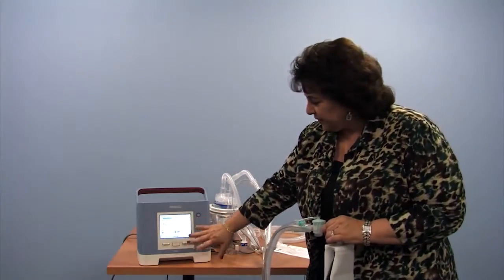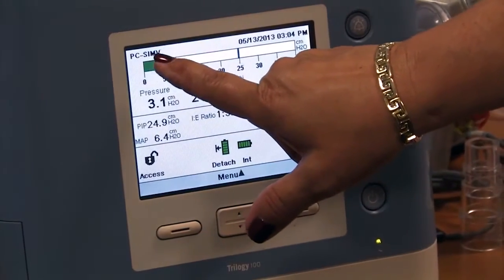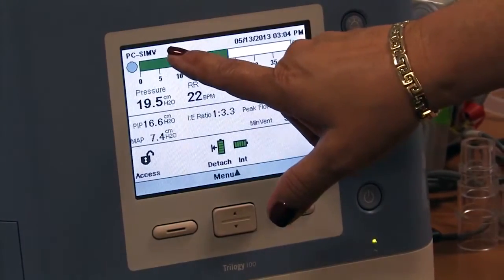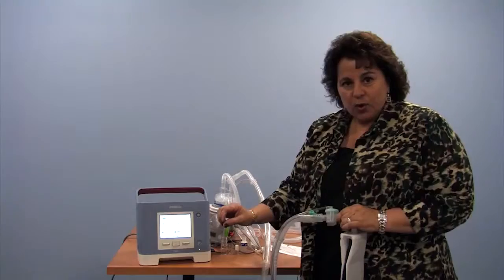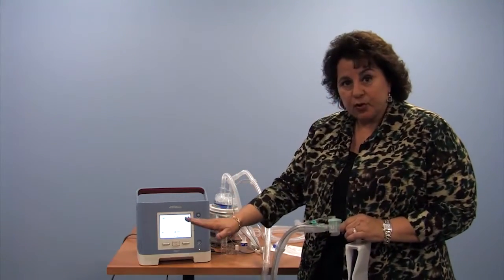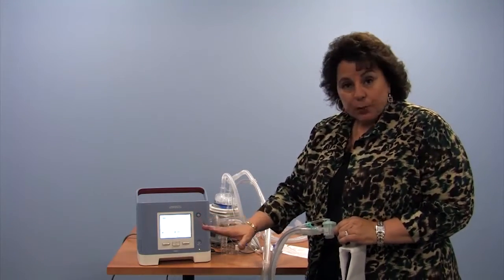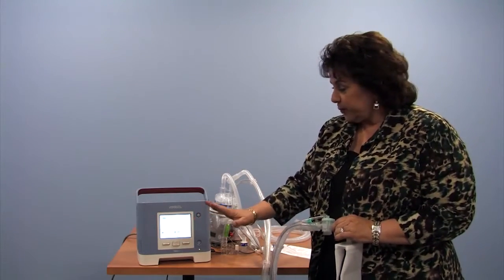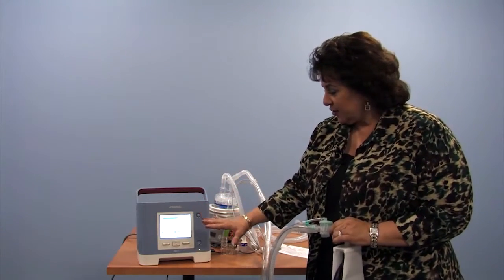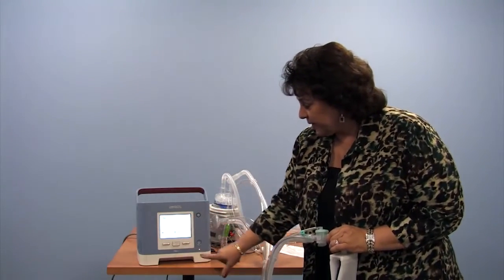So what we see now on the face of this machine, we're in the pressure control SIMV, or synchronized intermittent mandatory ventilation mode. Common modes that your child might be using could be volume control SIMV, pressure control SIMV, or the assist control mode for volume or pressure. This device offers all of those different modes of ventilation. For the purpose of this video, we are in pressure control SIMV.